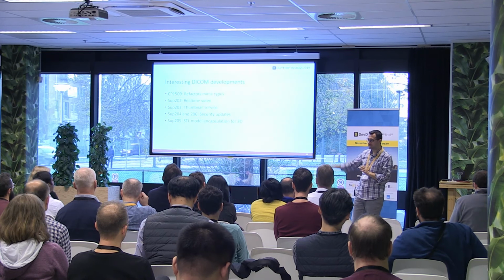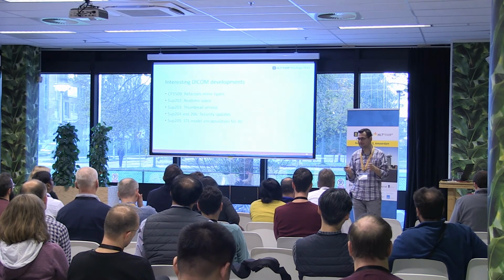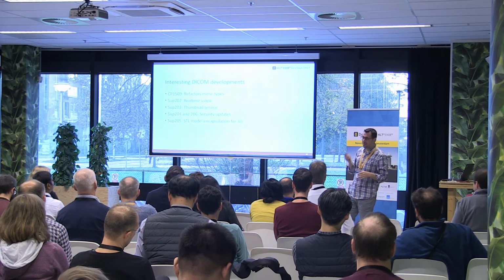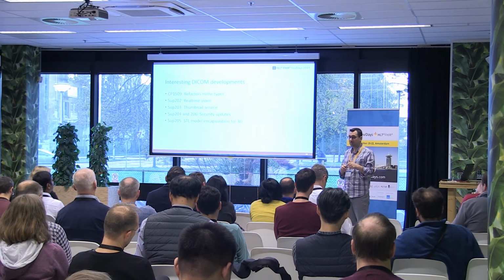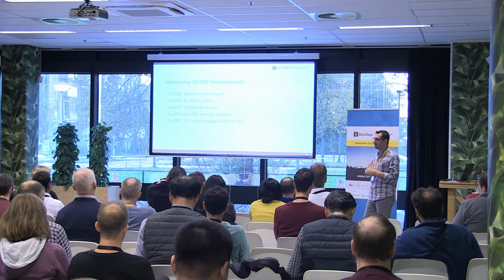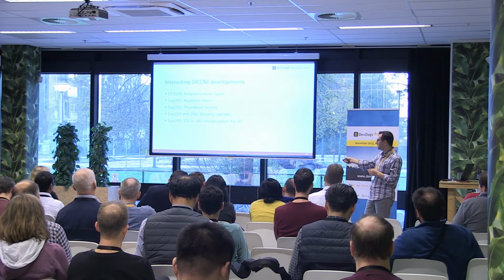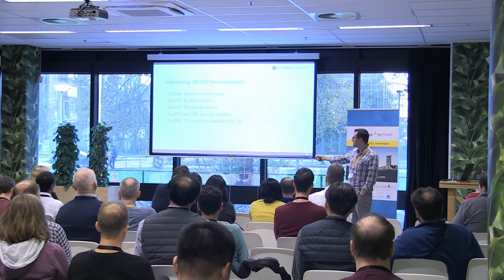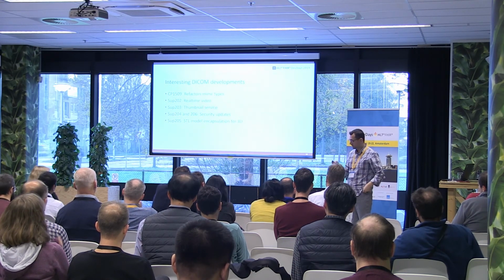DICOM has had security built in since day one. The problem is most vendors don't implement it. That's the sad part. So if any of you work for institutions or hospitals, tell your vendors to support security, and if it is supported, make sure they implement it, because it's supported things like TLS for a very, very long time. One cool thing about DICOM, you can encapsulate anything in DICOM. So one of the newer updates to the standard allows you to encapsulate 3D models for 3D printing.